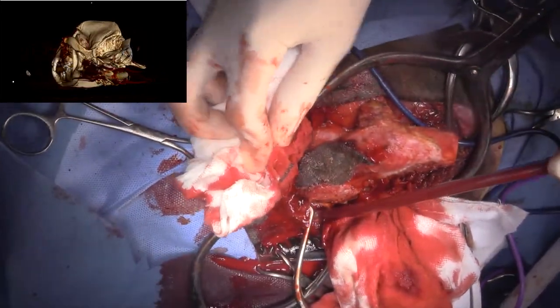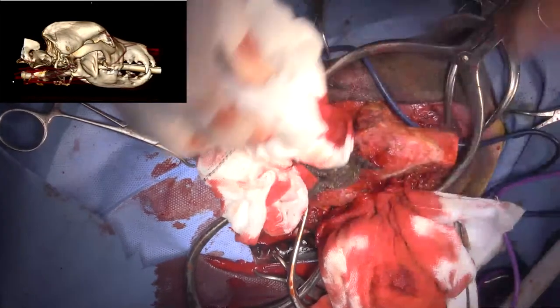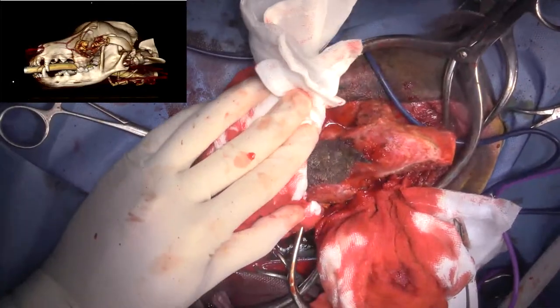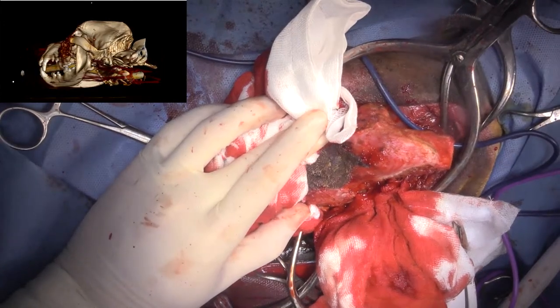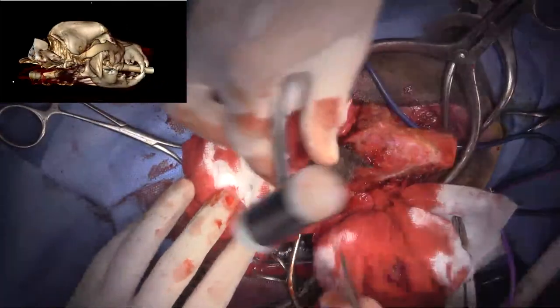Can I get a bigger osteotome, please? I come around that side. Switch places with me, please, Jeff. Make sure I'm all the way through up here. All right, let's see what you got. The middle one, please. Thank you. It's also possible that the dorsal nasal bone. Just keep sucking in there for me, please.